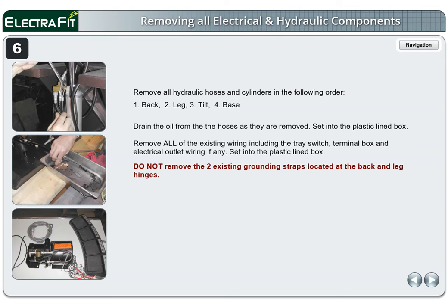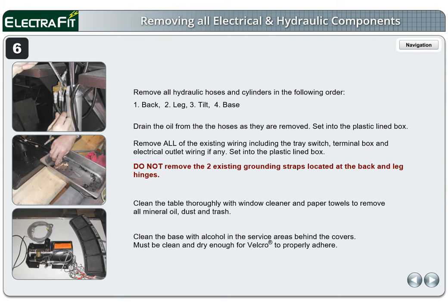Do not remove the two existing grounding straps located at the back and leg hinges. Clean the table thoroughly with window cleaner and paper towels to remove all mineral oil, dust, and trash. Clean the base with alcohol in the service areas behind the covers. Must be clean and dry enough for Velcro to properly adhere.